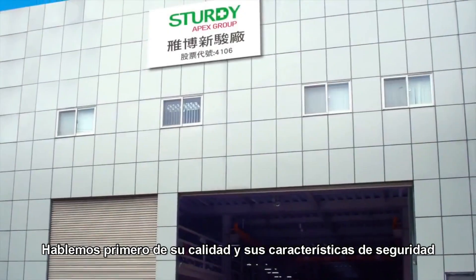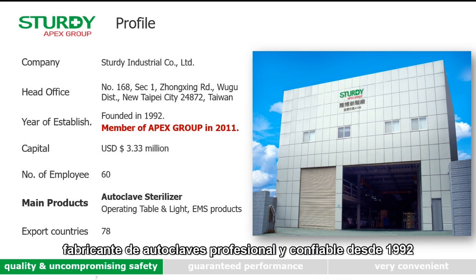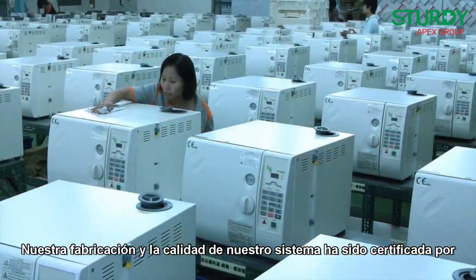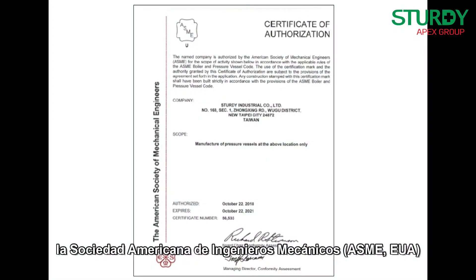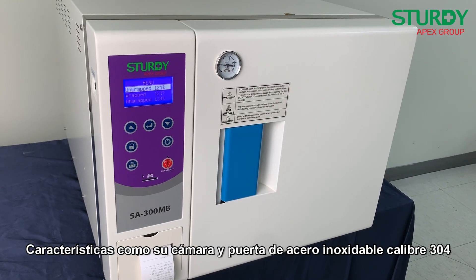Let us first talk about quality and safety features. As part of the Apex group, Sturdy Industrial has been a professional and reliable autoclave manufacturer since 1992, supplying autoclaves to over 78 countries. Our manufacturing and quality system have been certified by both the American Society of Mechanical Engineers (ASME) of the USA and the Pressure Equipment Directive (PED) of the European CE.